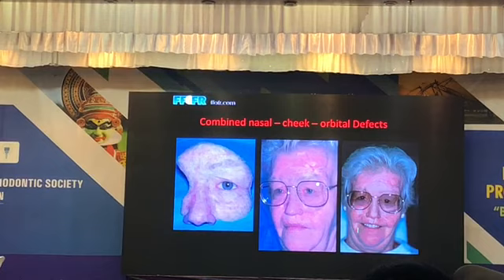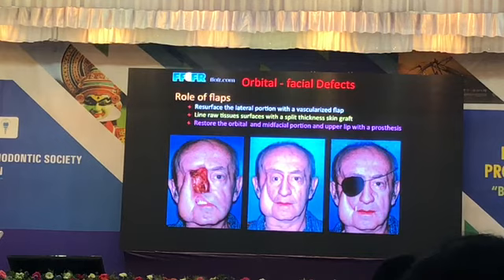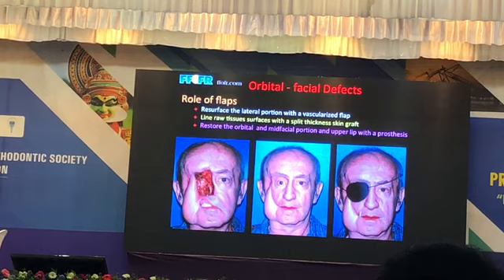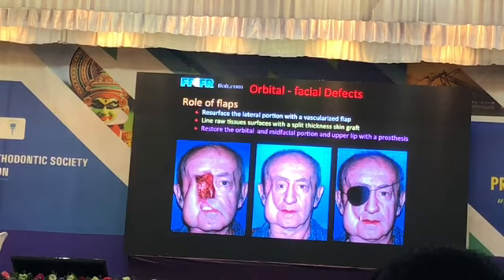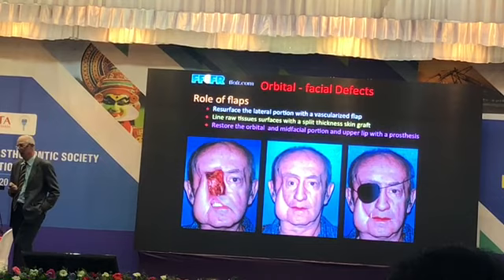There's a lady I did, I don't know, 15 years ago. Just a couple of implants is all it takes. This is a person done 30 years ago in the UCLA clinic. And this guy didn't really use his appliance very much because it was not retained with implants. It was retained by means of adhesive. And it's just not enough to hold a big appliance in place. So what did he do? We made an eye patch to hold it in position. Today, you don't need to do those kinds of things with implants.